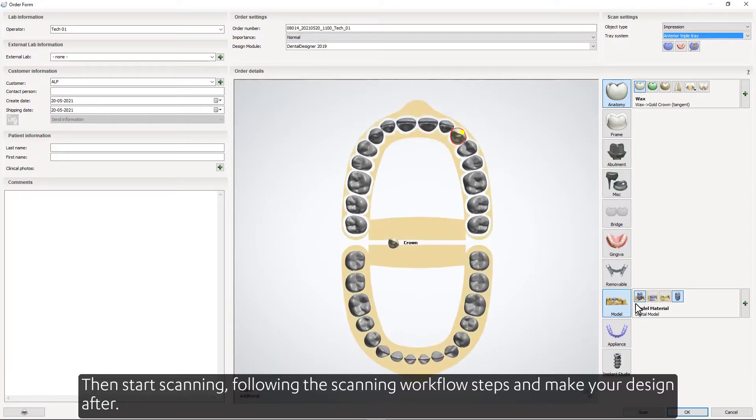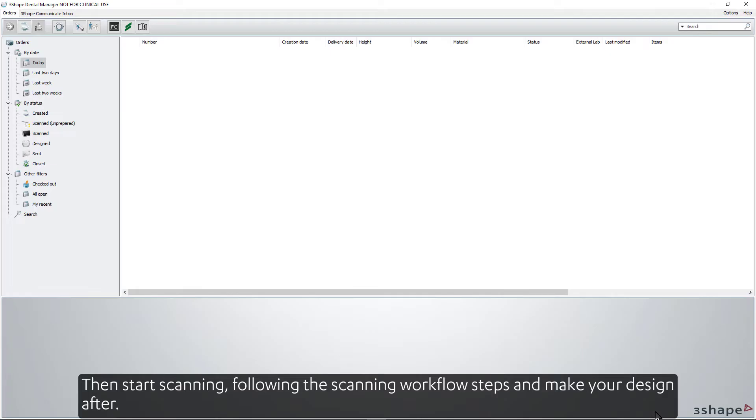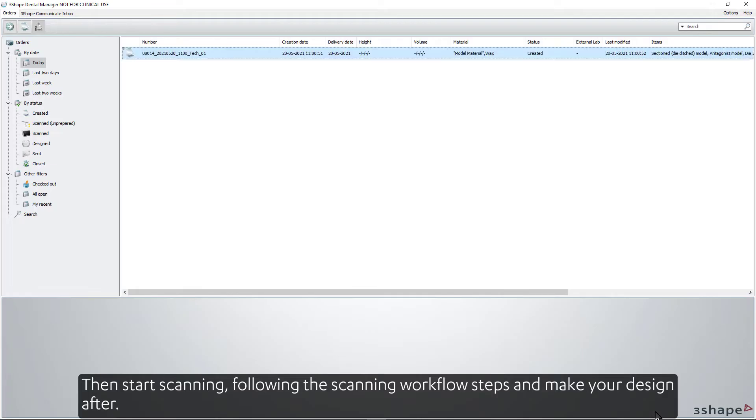Then start scanning, following the scanning workflow steps, and make your design after.